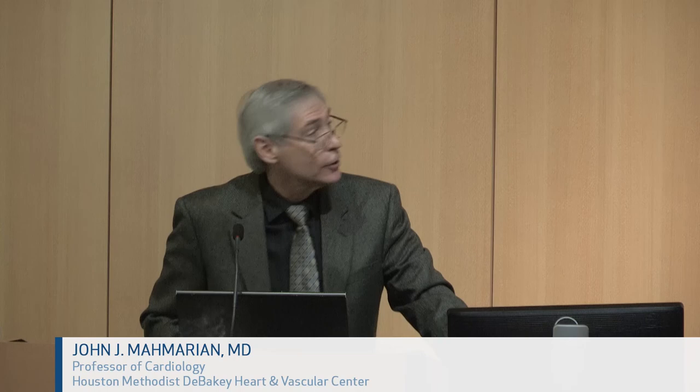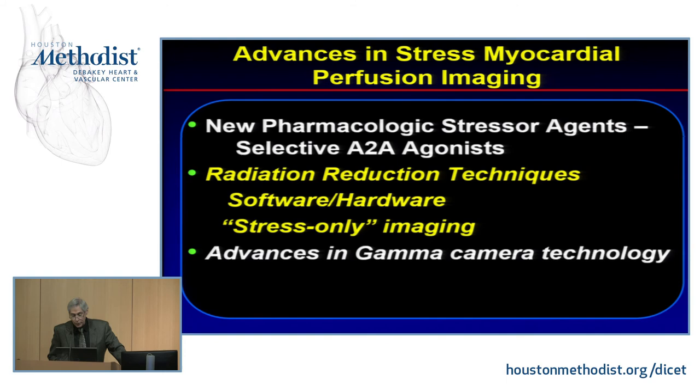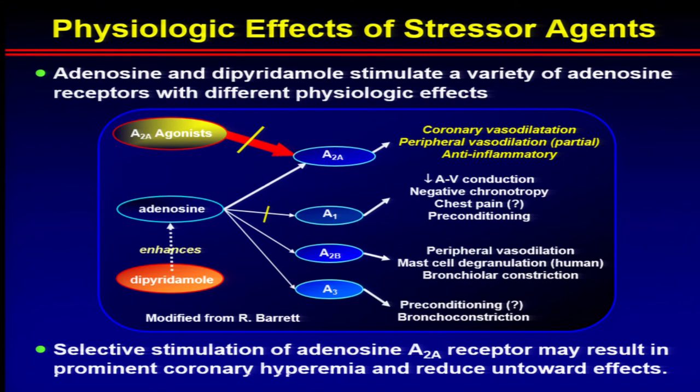Okay. So good morning, and I'm going to try in the next 15 minutes to give you a look at nuclear cardiology. We're going to go through several different areas: perfusion, pharmacologic stressors, different radiation reduction techniques, advances in gamma camera technology and software, and radiotracers, and where we go with those. Now, first of all, as you know, pharmacologic vasodilators have really changed how we do things in nuclear cardiology, but there are a lot of side effects because we're only interested in activating the A2A receptor, and unfortunately, with adenosine and dipyridamole, we activate many other receptors.